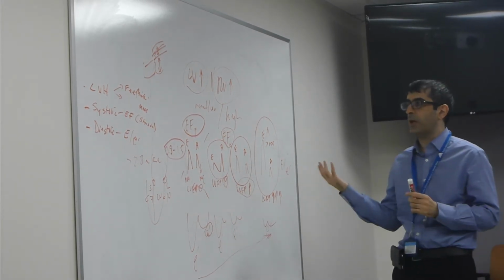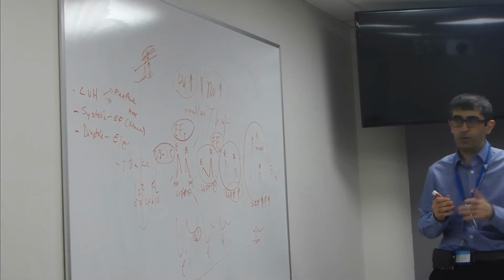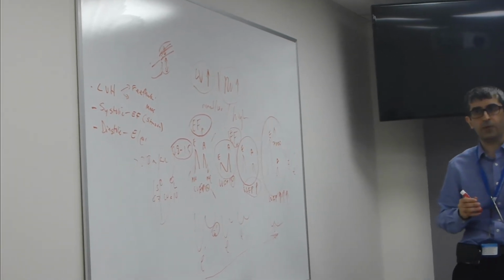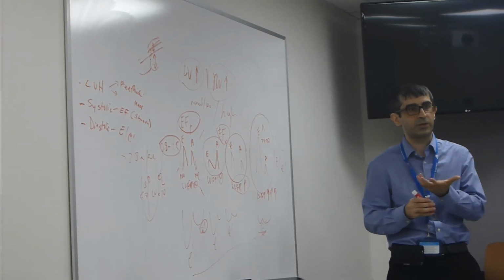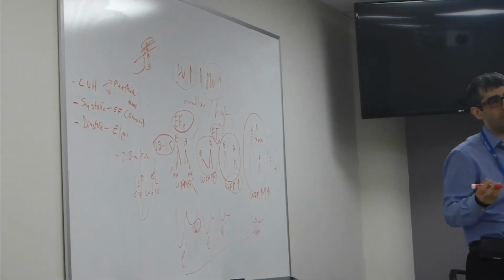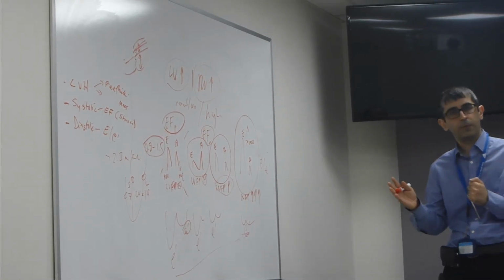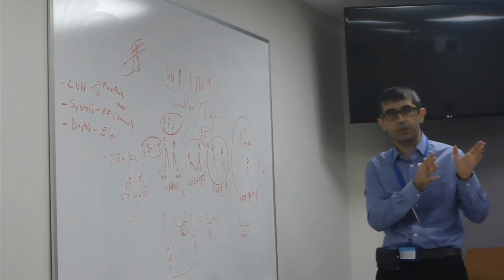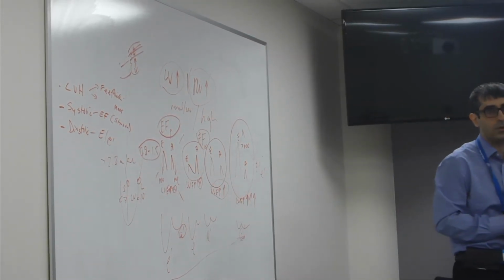So this is essentially what the treating physicians are looking for. Yeah, you can report the stages or whatever, but nobody really understands what it means. The internal medicine physician who reads this report and sees that, wonders what it means. When you say that the filling pressures are high or normal, people get an idea, okay, so maybe this is heart failure, maybe this is not heart failure.